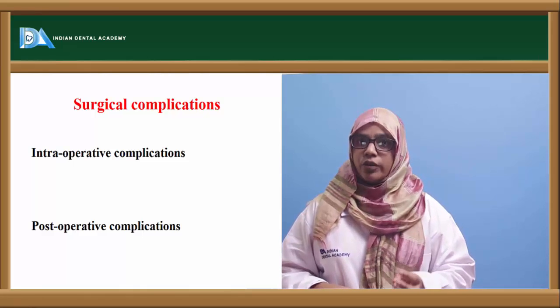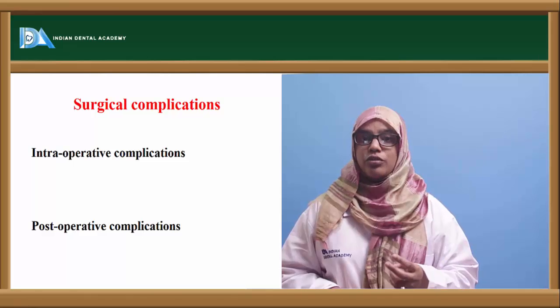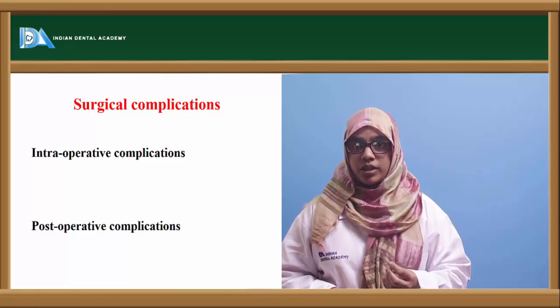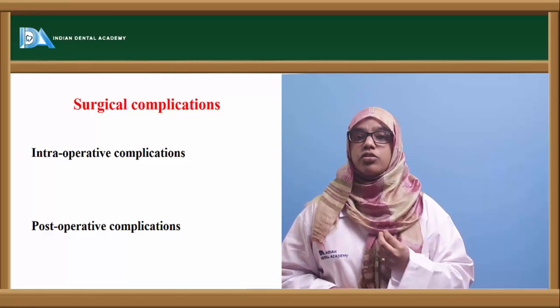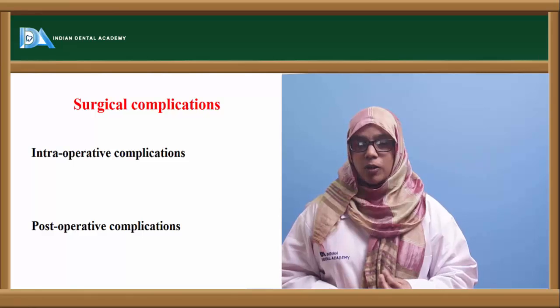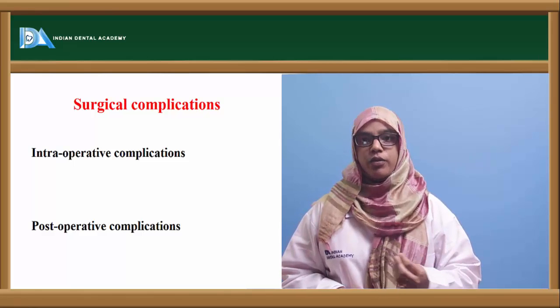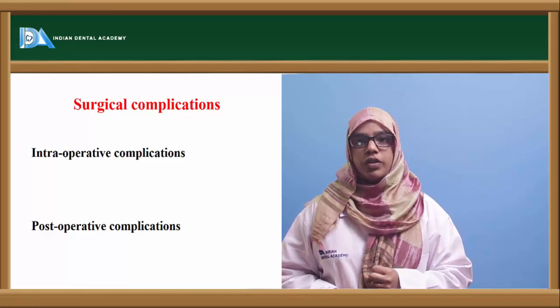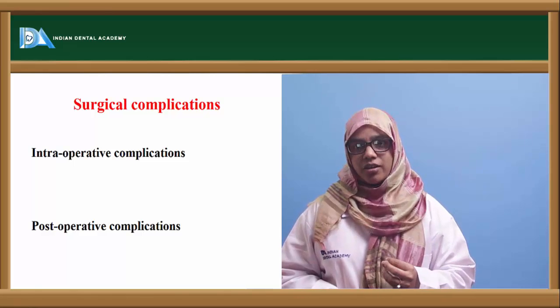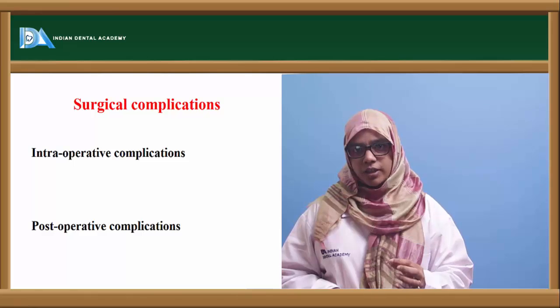Your angulation may not be proper. You need to check. That's the reason surgical guides come into the picture, and your OPG helps you see the position of the vital structures. You might have damaged the inferior alveolar canal or perforated the nasal floor or the sinus floor because of inappropriate dimensions. Then a bone fracture can occur if the crestal bone is very thin.